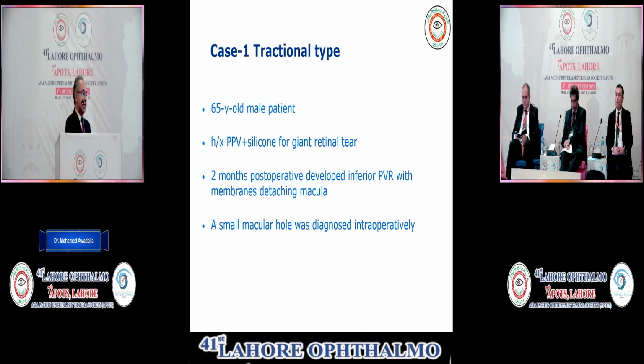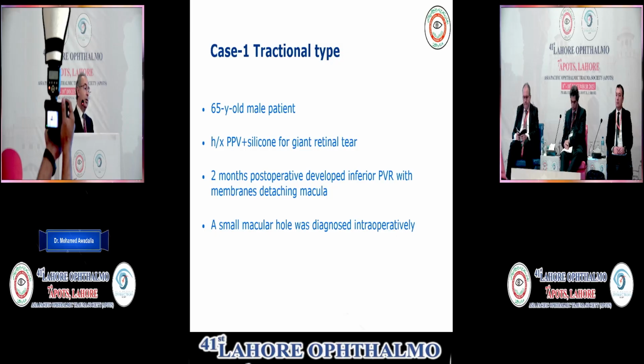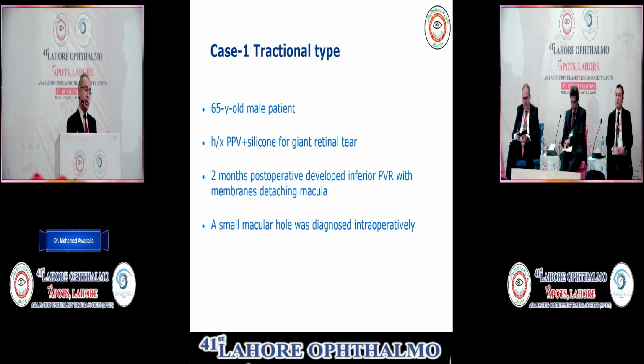The first case is the tractional type retinal detachment. This is one of my patients. I did pars plana vitrectomy with silicone oil for a giant retinal tear and he presented 2 months post-operatively with inferior PVR and membranes detaching the macula.